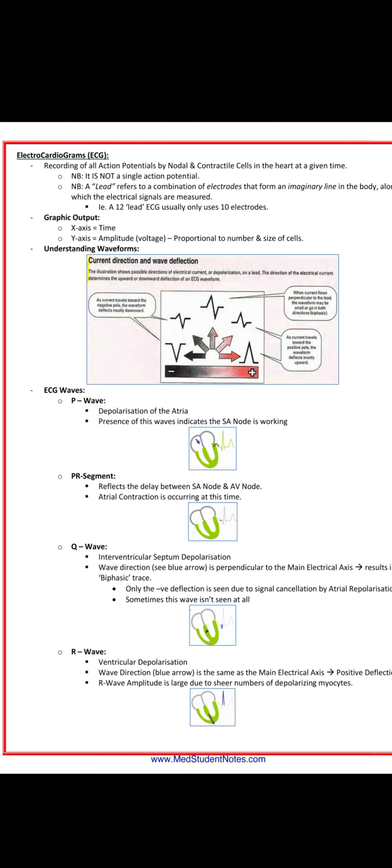So the x-axis is time and the y-axis is proportional to the number and size of cells.